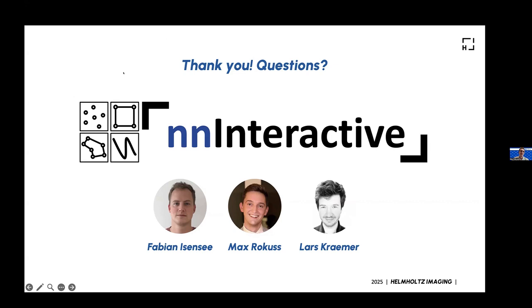Well, definitely a very good question. As I was telling earlier, maybe the way we prompt is not optimal. This is also still an open research question. So not only how we encode the prompts, but also where you insert the prompt. For example, what we do now is early prompting. So the prompt is inserted similarly to the image, right?